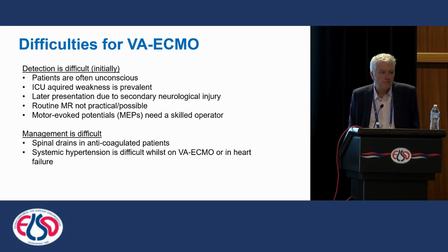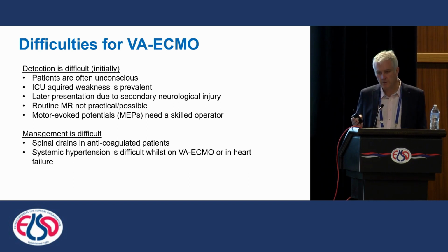It's not really practical for us to do MR in our VA ECMO patients. I don't know of an MR safe or MR conditional pump yet. And again, things like motor evoked potentials, it's a massive resource we plump into aortovascular surgery because we need skilled operators. I'm not sure we're quite there yet for all VA ECMO patients.